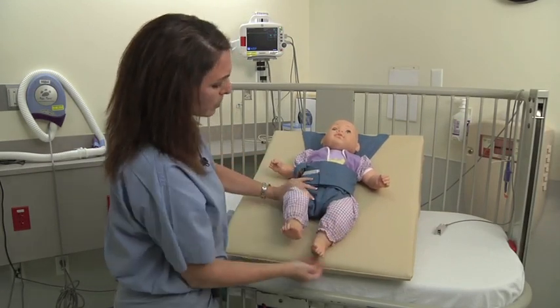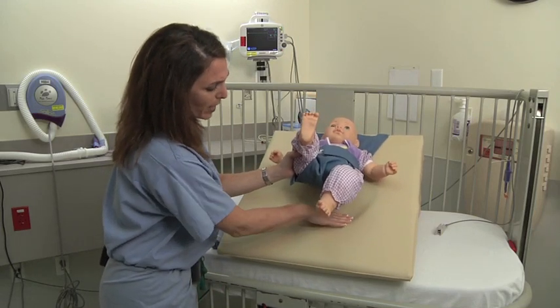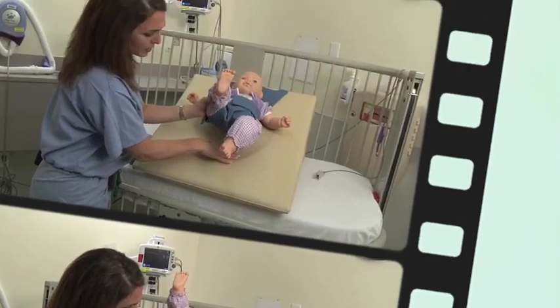There's our baby. You also want to make sure that your baby's bottom is sitting at the bottom of our nest. This is our nest.